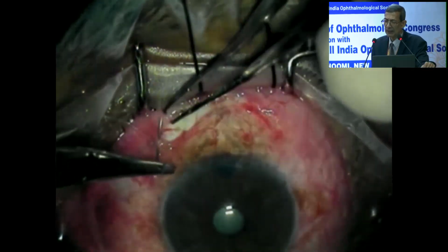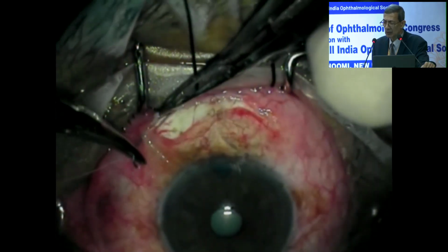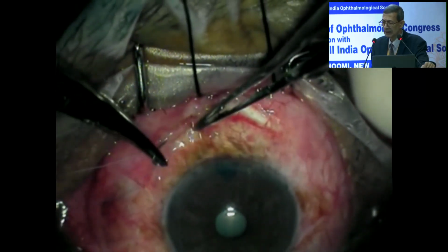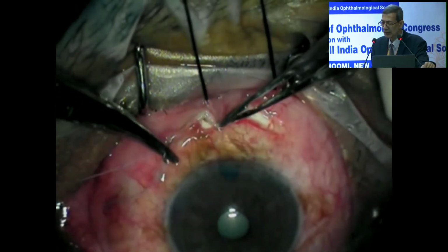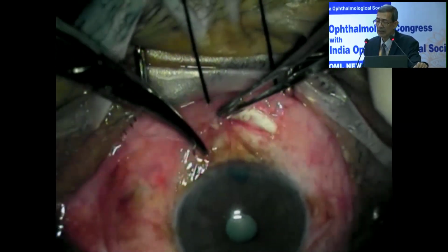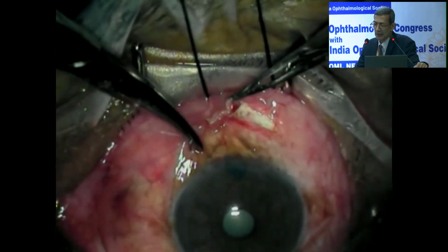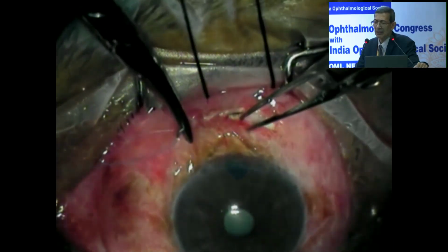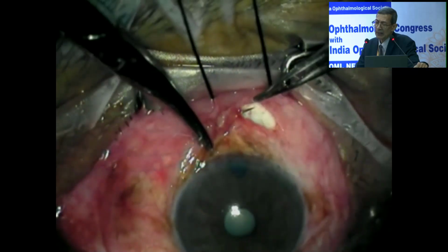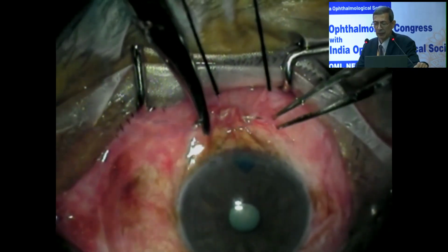In the beginning you can do the suturing, say in the posterior inside out, then outside in; in the anterior it is inside out and then outside in. In the posterior it is inside out and then again outside in. That's the way the entire length of the conjunctivotenon layer can be threaded. It requires a little practice. It's like the closure of the subcuticular stitch we used to do for skin. And the entire suture, if in the beginning phase of surgery somebody can do in steps, no problem.